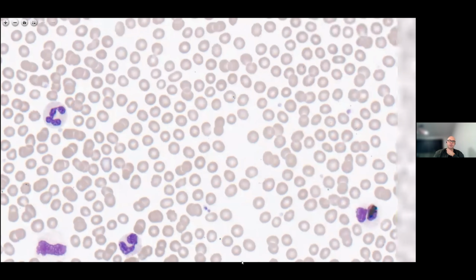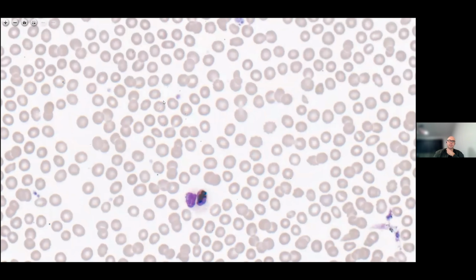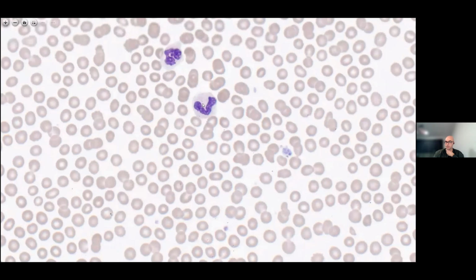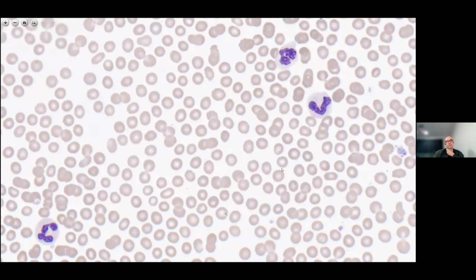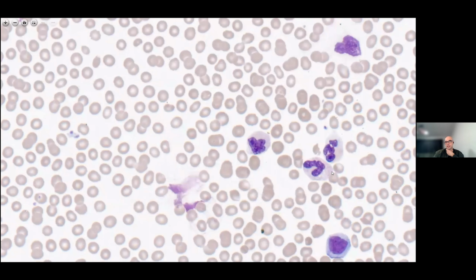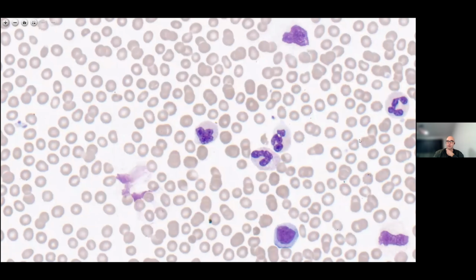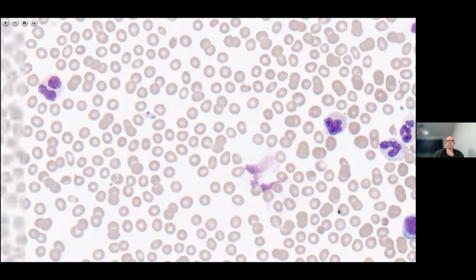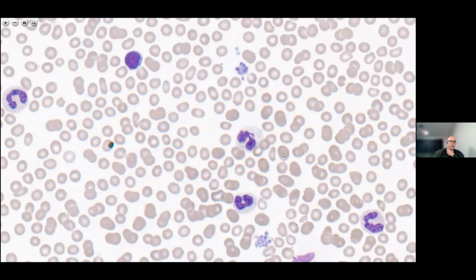But given the other neutrophil features I'm seeing, where there is a little bit of granulation, it's not increased. The granulation isn't overly stained dark, so I would say the granulation is normal for these neutrophils. I can see granulation in the majority of neutrophils, so I wouldn't say it's hypogranular, which might herald a dysplastic process going on in the marrow.